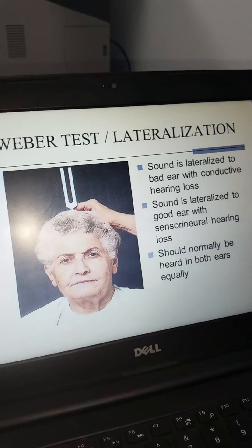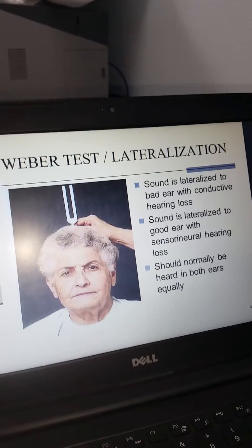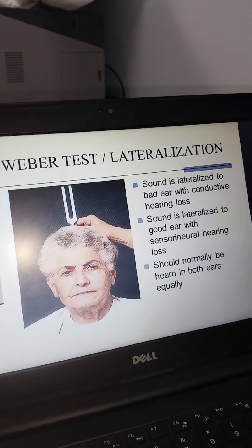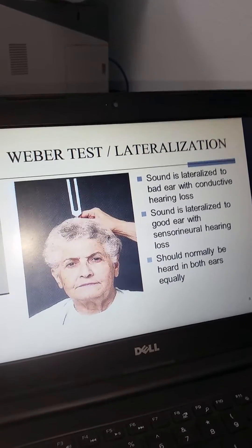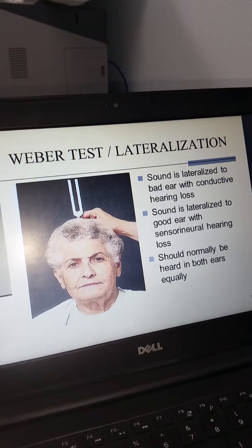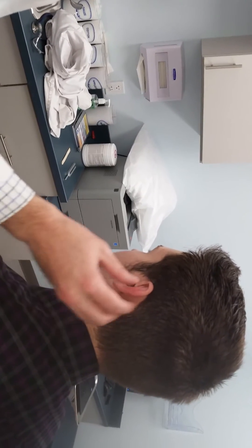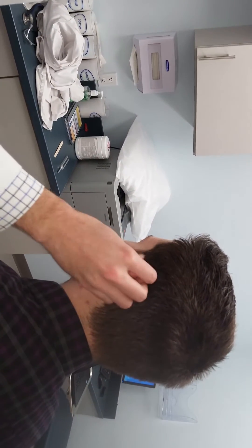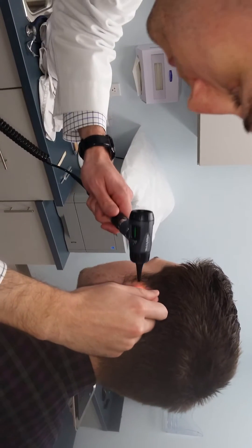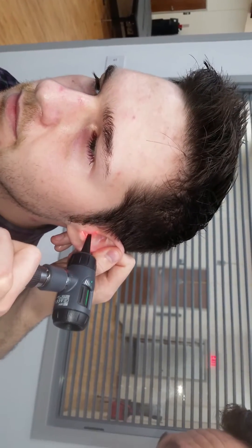Before we go on to the Weber and Rinne tests for lateralization, sensorineural, and conduction loss, let's take a look at what the physical exam up to that point should look like. We will not be doing the GRIP assessment, but focusing on the external and internal examination of the ear. So first I'm going to examine the auricle and behind the auricle. Next, palpate the auricle and the tragus. Now I will observe the auditory canal.